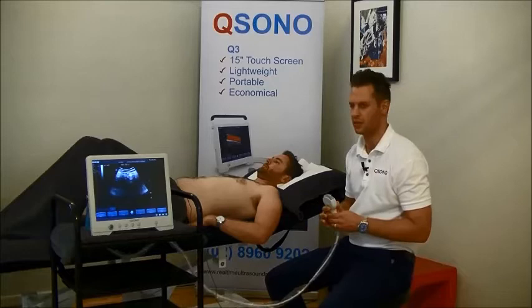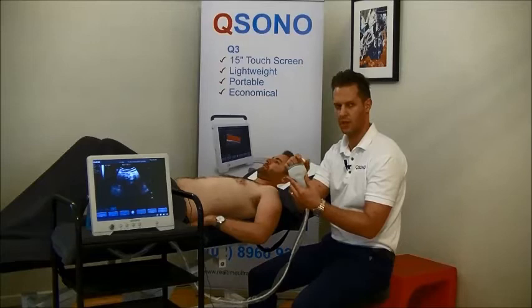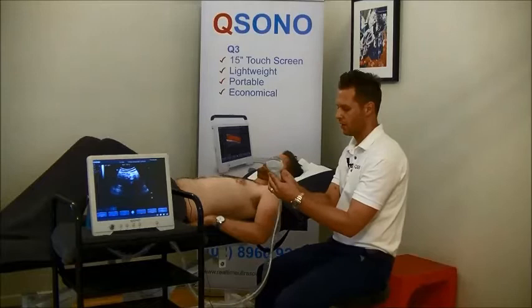For the probe positioning, we're going to place the probe just above the pubic bones, and the left hand side of the screen, which is where this little dot here is, is going to be on the patient's right hand side. The first image that we're going to take is going to be a transverse image. So let's put the probe on the patient and then I'll show you what we have to do to optimize the image.